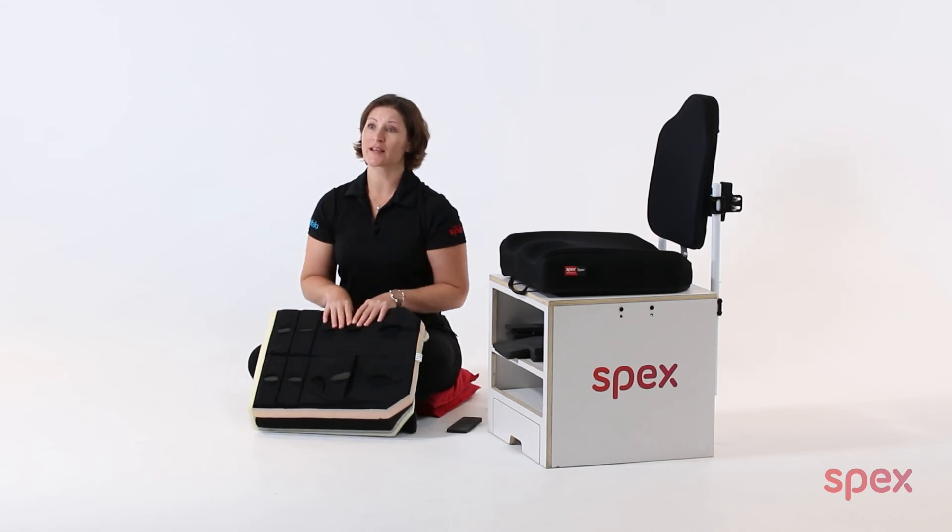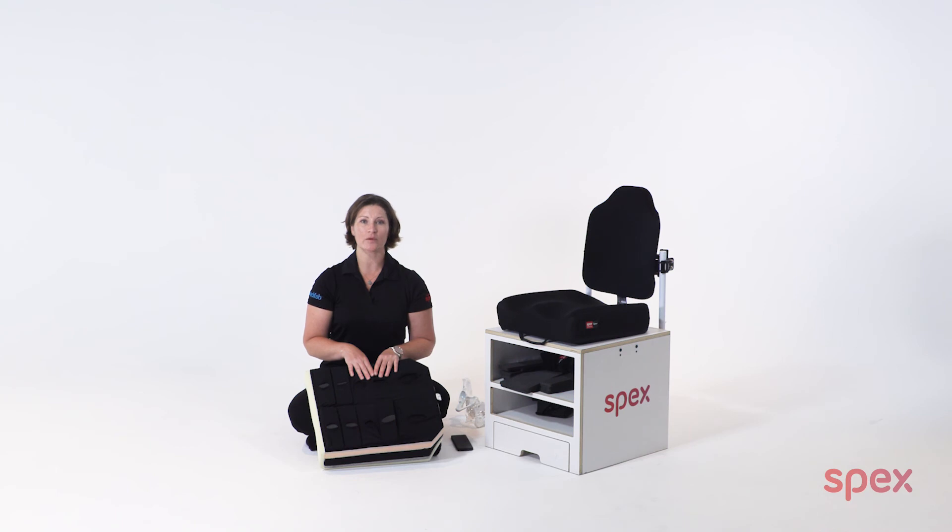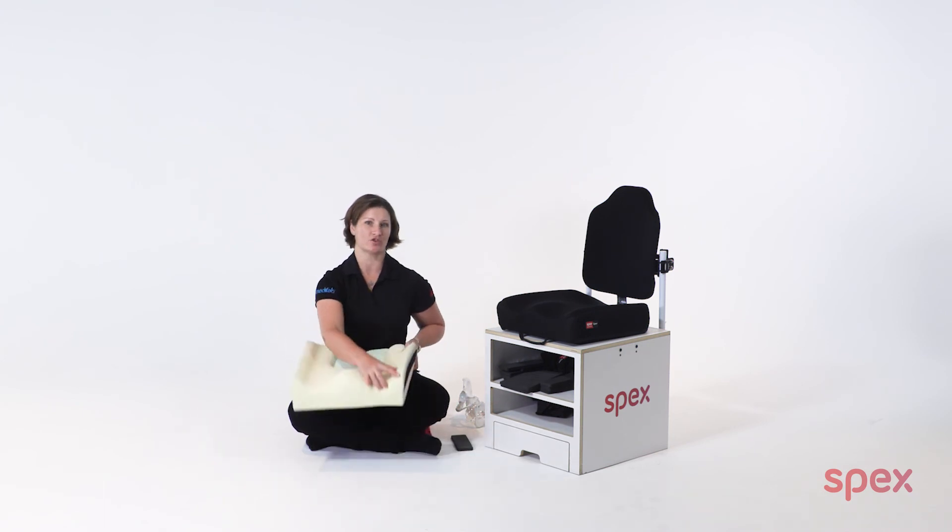Please refer to the SpexFlex video for more information on this. As with any wheelchair cushion, skin integrity does need to be monitored following any changes, and this is recommended practice following any cushion adjustments.